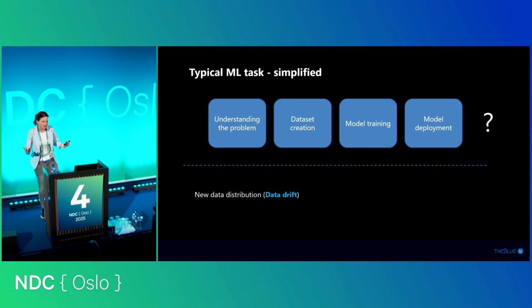Or if you're like in our example, if you would apply a different MRI scanner, the data would be a little bit different. Or if we would be building a recommendation engine, people will change their behavior. Like they will change their preferences, so your recommendation will not be as good as at the beginning. Apart from that, while developing our systems, we might want to add new classes.